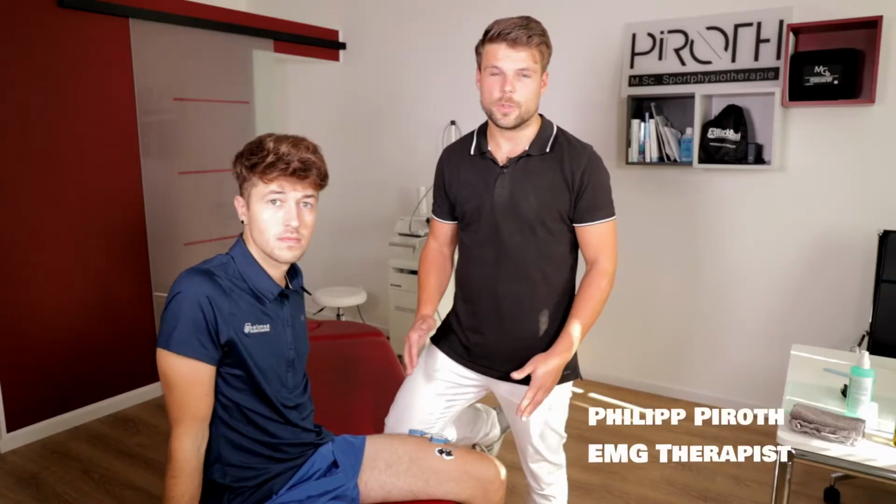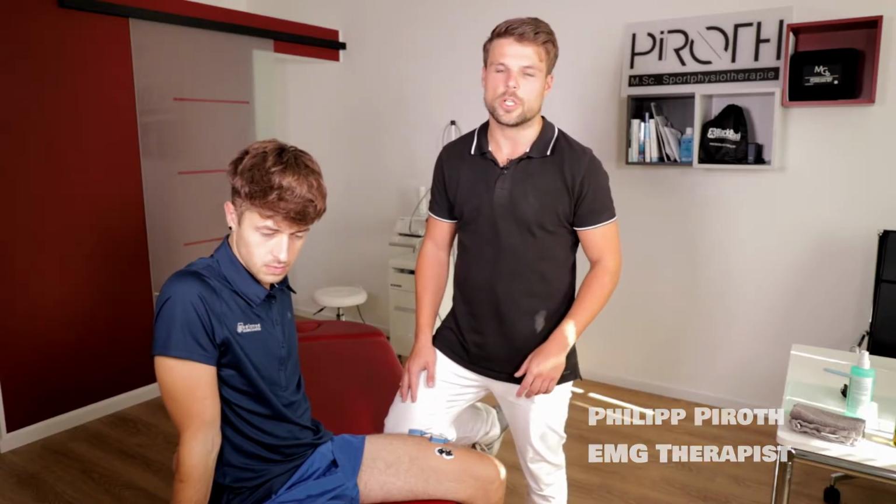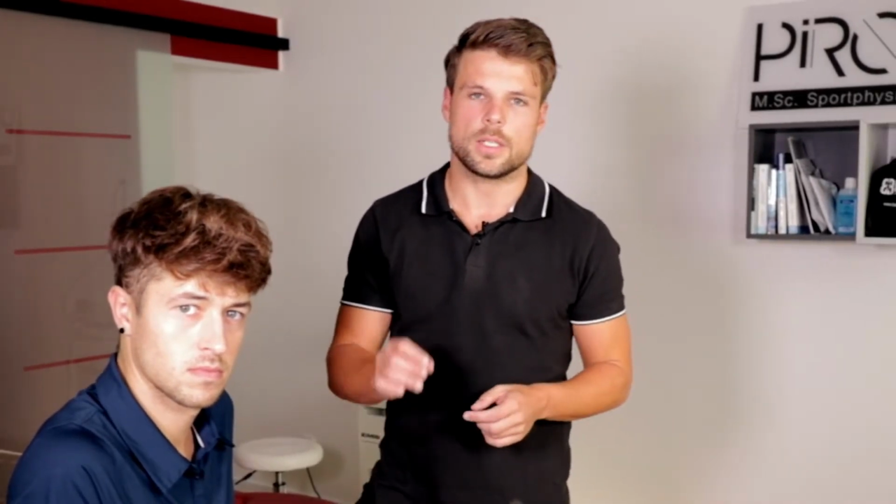Step 5. Using your EMG in a functional way. After the preparation, we will come to the measurement and how you use the EMG in a functional way. Before you start with the EMG, always keep in mind that your physical and clinical examination is the focus. After the physical and clinical examination, you can decide which muscle you want to measure.